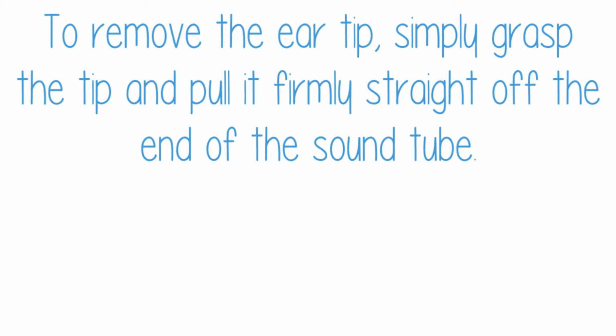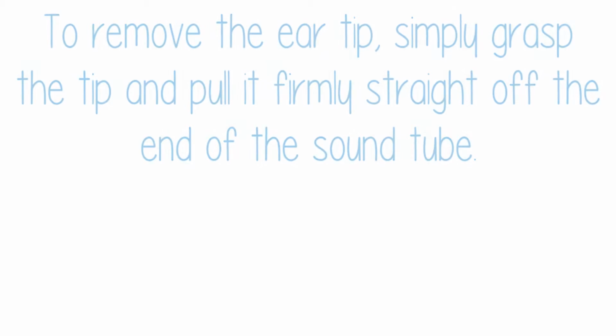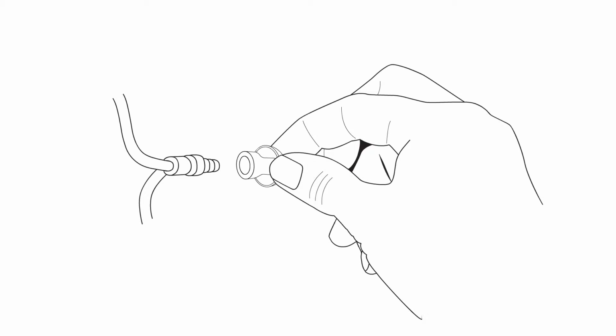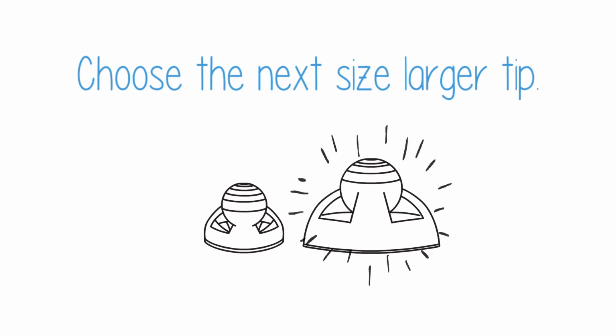To remove the ear tip, simply grasp the tip and pull it firmly straight off the end of the sound tube. Choose the next size larger tip.